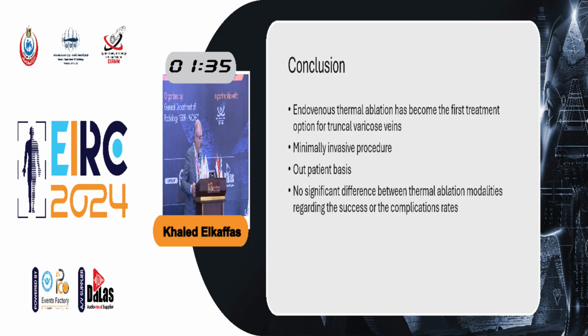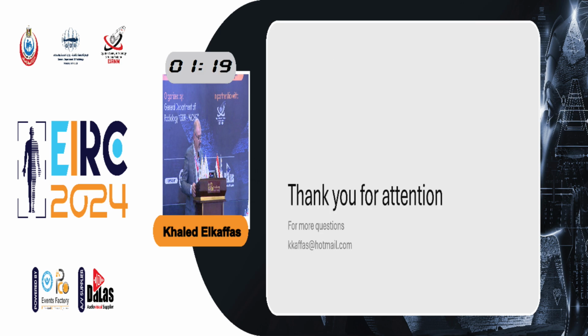So finally, I will conclude that endovenous thermal ablation has become the first treatment option for truncal varicose veins. It's a minimally invasive procedure. It's done on an outpatient basis with no significant difference between thermal ablation modalities regarding the success rate and the complication rate. Thank you for your attention.